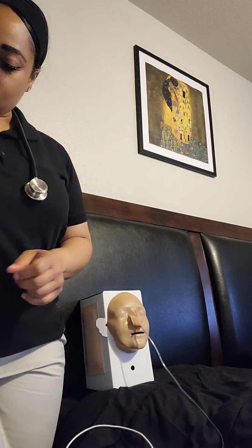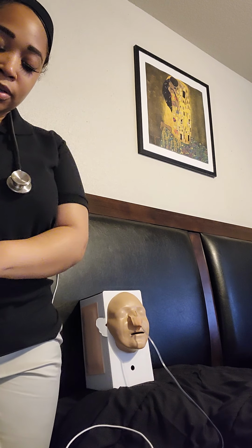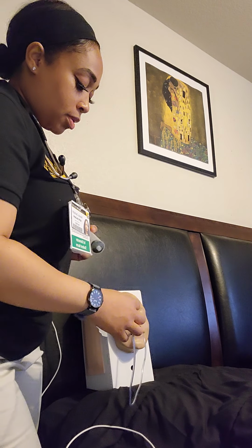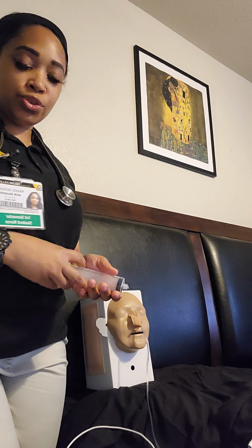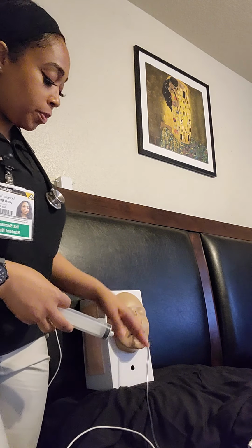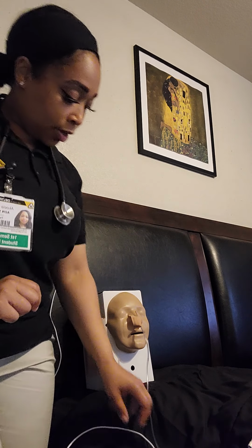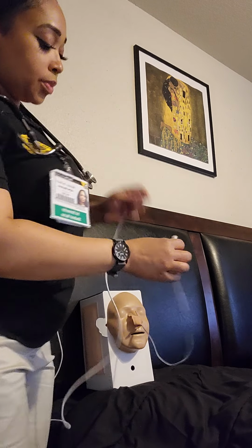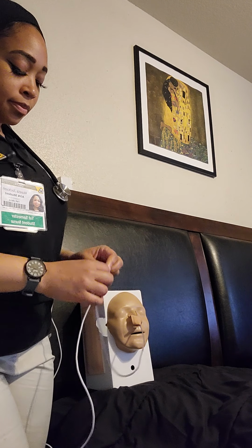So what I will do next is take the gastric content from the graduated cylinder and flush it back into the NG tube because the patient will need those gastric enzymes to digest their tube feeding. So once the whole 250 mLs are inserted back into the NG tube, I will go ahead, and of course the patient is not on suctioning anymore, so the patient was disconnected from suctioning. So now I can connect the tube feeding to the patient.